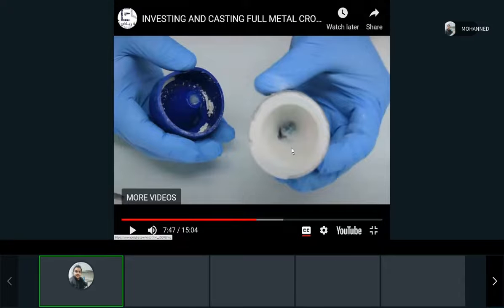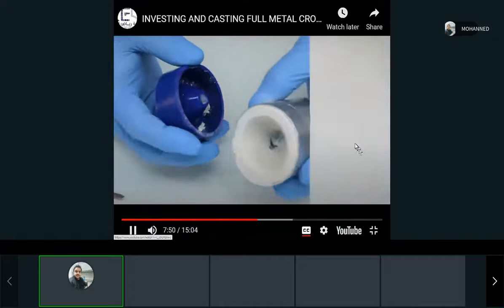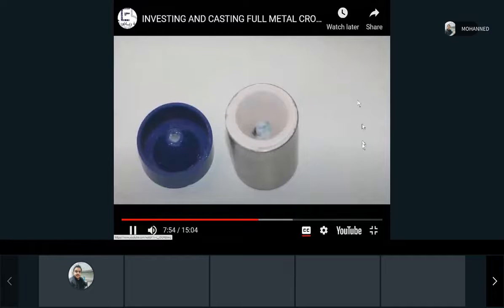We will put a metal inside. We will melt a metal, and we will shoot it into that empty space, and this will form the crown. Again, you will see that. So we have that now. You'll see they will take it out and put it in an oven.